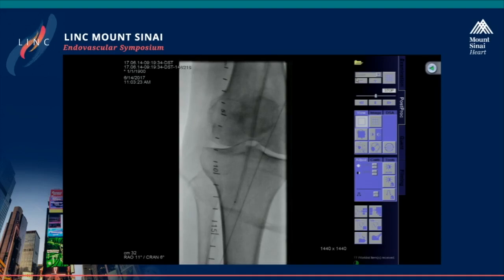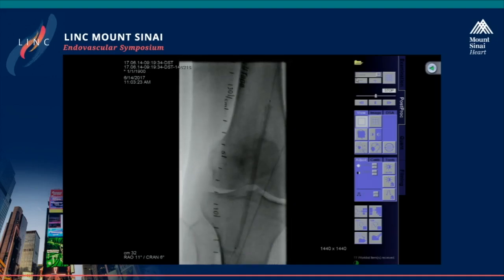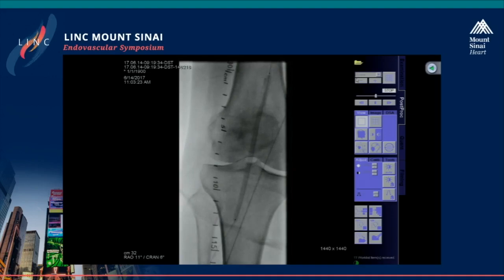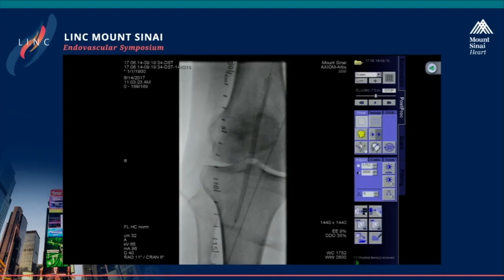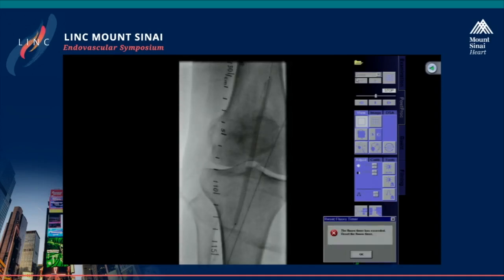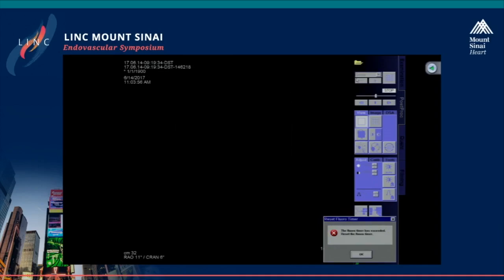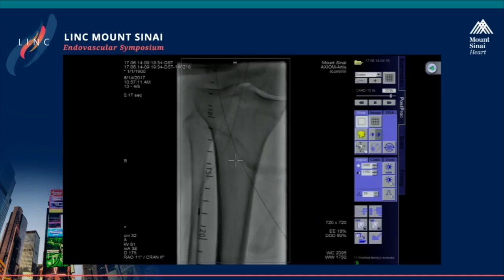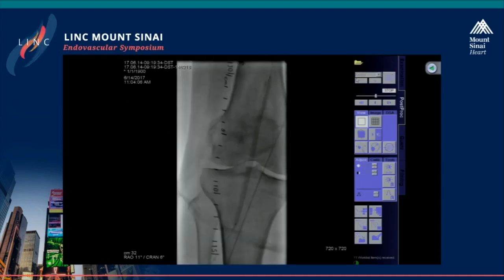So, PK, as you're doing that, let me just say, to support your decision process, I would have done exactly what you did there, and that device is a perfectly sized device for that trifurcation. One thing I'll say is your IVUS showed that you were very clearly true luminal. Even if you weren't true luminal and you were subintimal, I have very few concerns with using directional atherectomy, in part because you can direct it toward the side that you want to cut. You can direct it toward or away from the trifurcation. And so I've reconstructed many trifurcations with the benefit of being able to steer that cutter where you want it.